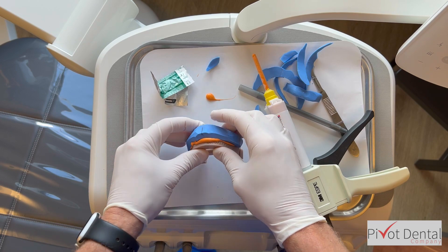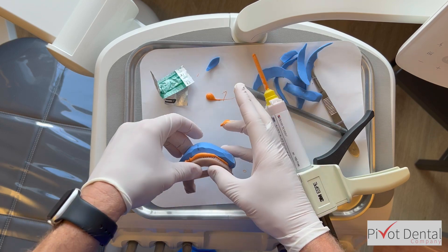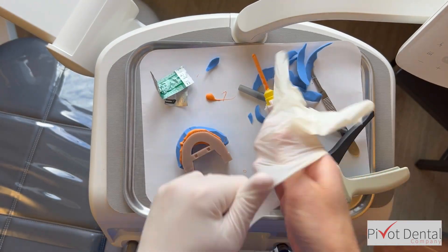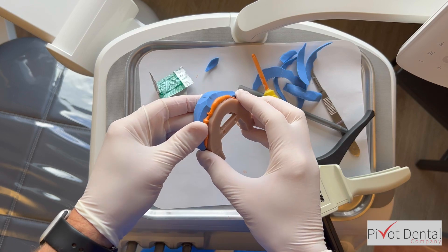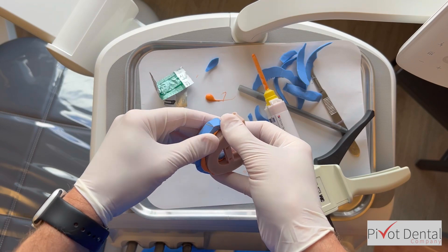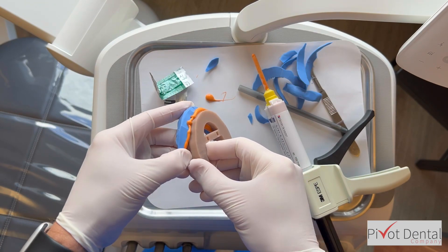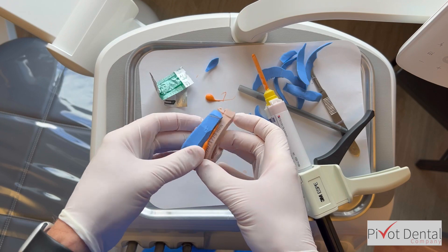I take the model, line up teeth 8 and 9 with that mark, and squeeze it together. The excess comes out and I press it down firmly — it makes a little bit of a mess. Then I just let it set. Once set, I separate it again. There's a tighter fit now so there's a greater chance wax might come off some teeth. I peel it from the gum line to help loosen it up and lower my chances of anything breaking off the model.